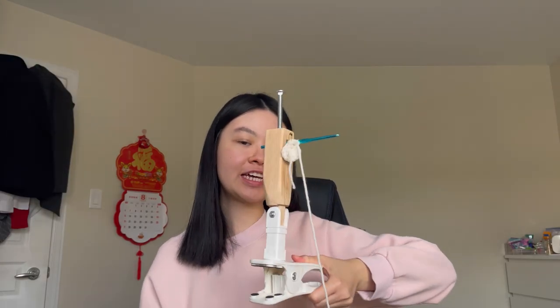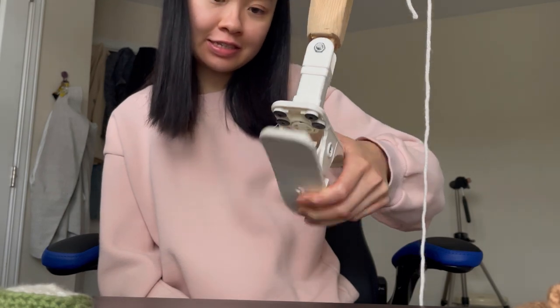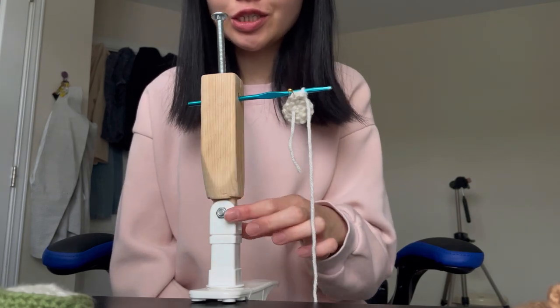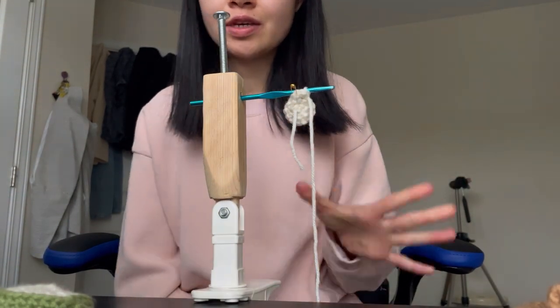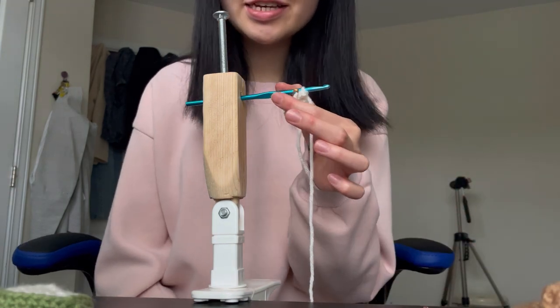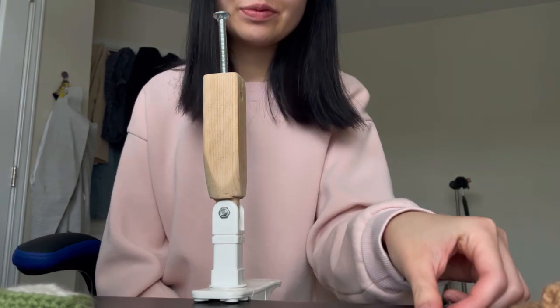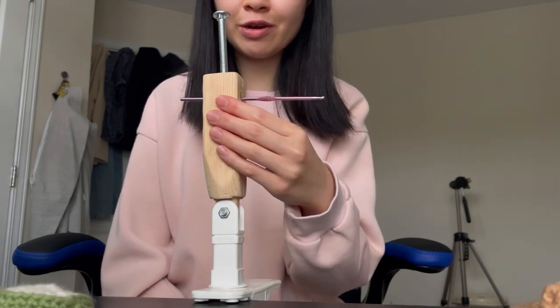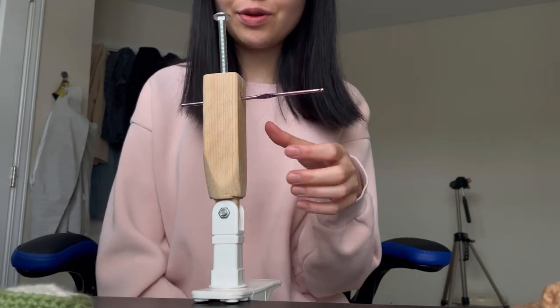This is my adaptive crochet aid and I'm going to do a little pan around it. Here we have the clip-on base, here we have the wooden part which connects to the base, and over here we have the screw. This is the crochet hook where you can take it off and put another crochet hook instead. Using the screw right here, I can turn it and it will be stable.